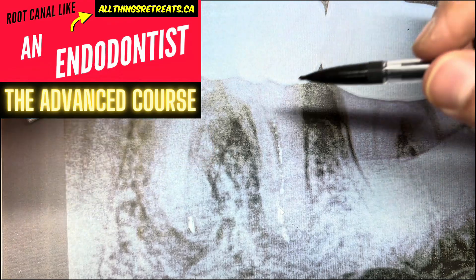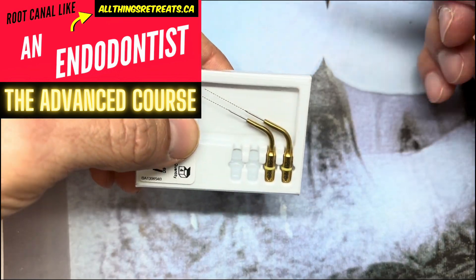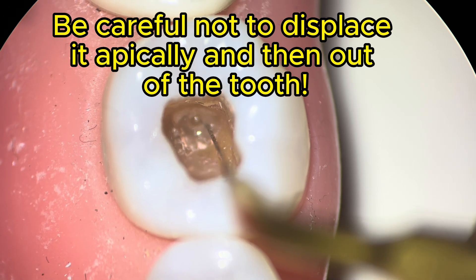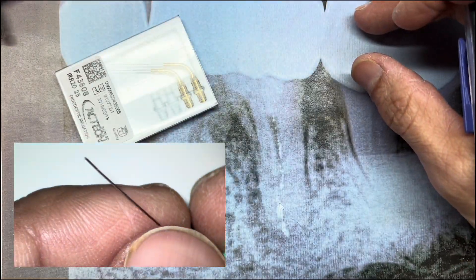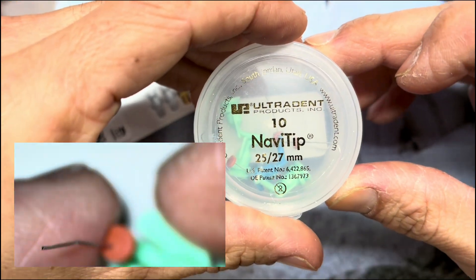There are a couple of ways we can try to get this out. The first is using ultrasonic energy to activate the irrigant — not to force it apically, but to dislodge it and then use little suction tips like this. These are what we call NaviTips. I'm sure there are a whole bunch of different ones.